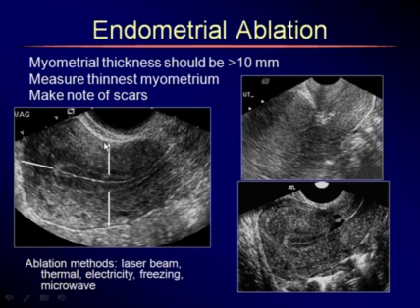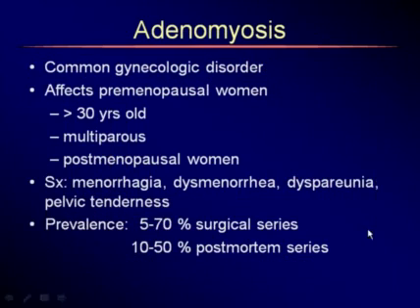So our job will be to measure the thinnest parts, not the thickest. So here would be the thinnest, not this thick part. Also make note of scars. So if there's a C-section scar, they will not be able to do that because of penetrating damage.